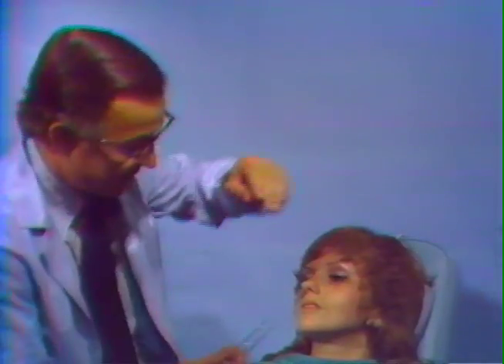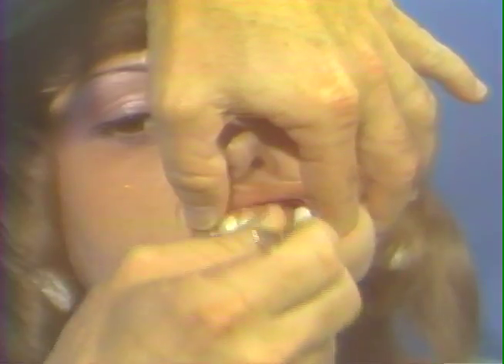Close contact of the cotton roll to the mucosa is important. Observe again the manipulation of the cotton pliers and external finger. Now open your mouth once again. To gain close contact of the cotton roll to the mucosa, when the cotton plier grasp is released, come to the bottom of the cotton roll with the tip closed, press it to the mucosa, let your retracting finger come down, your external finger holds the cotton roll into the mucogingival fold, the cotton forceps come out, and you now have good contact to the mucosa. Now open once again, and we will now remove this.